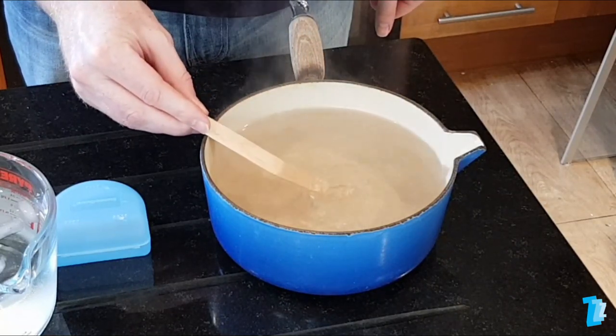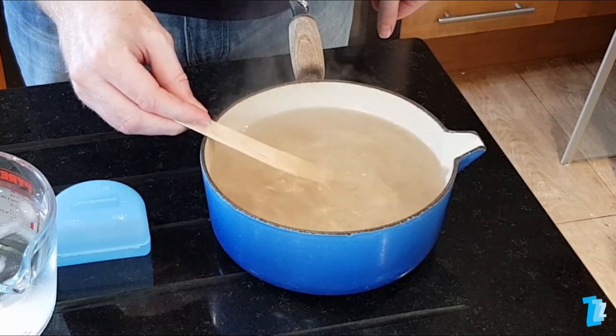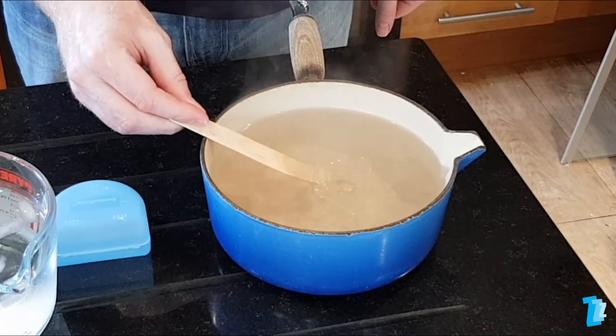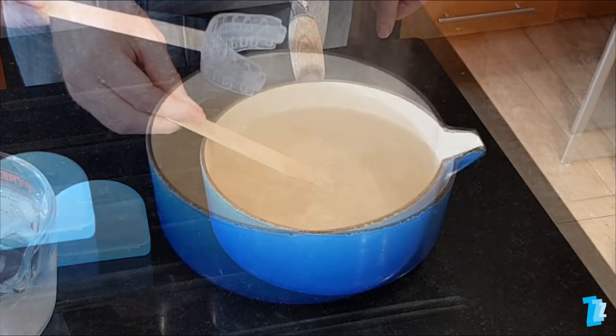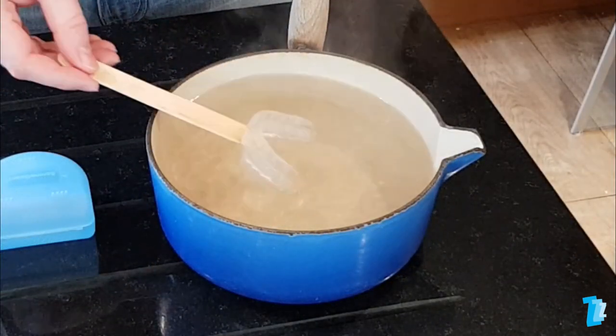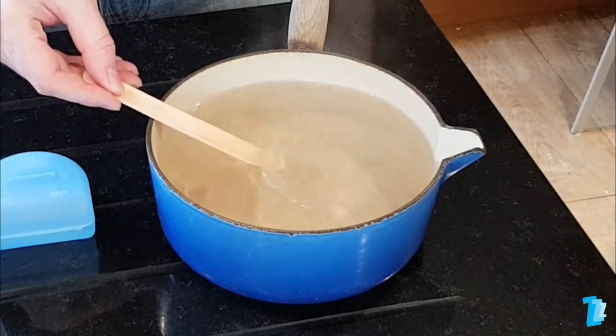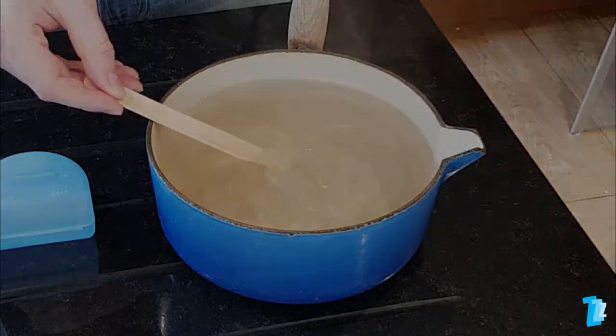Timing, when the device is in the water, is absolutely crucial. Don't count in your head — rely solely on a clock that shows seconds. The instructions state the device should be immersed for about 20 seconds. We strongly recommend that you don't exceed 20 seconds.